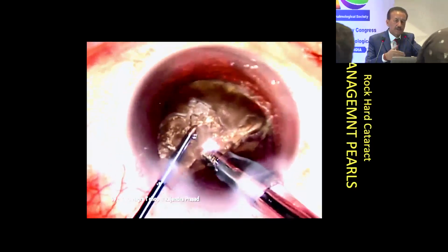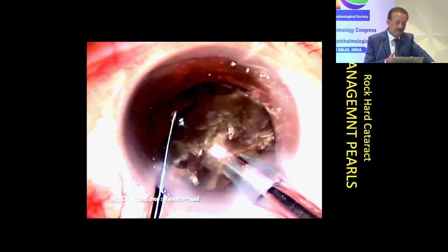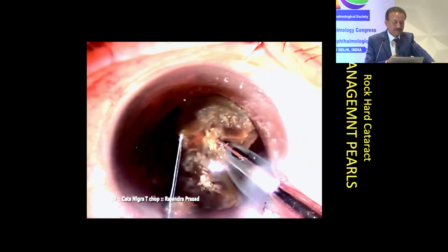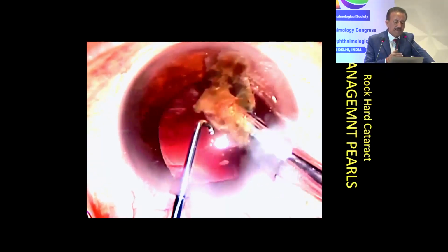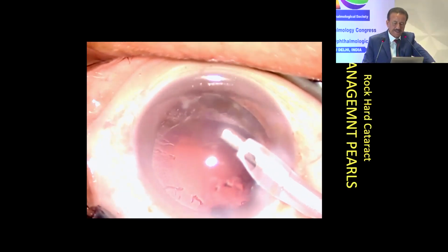Otherwise, normally you would require ECCE or MSICS in these cases. But here with this device, you can see even this kind of nucleus you can crack, and you can emulsify very simply, and you can see the pristine clear cornea on the next day itself.